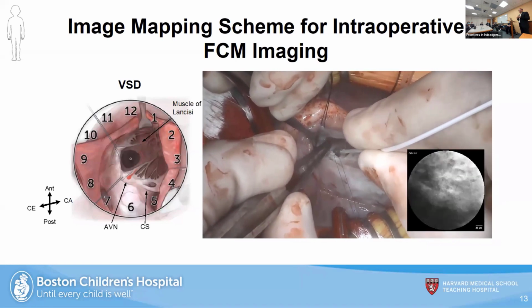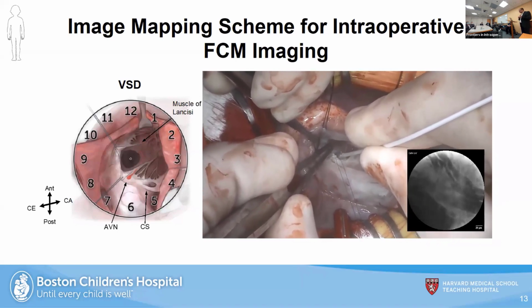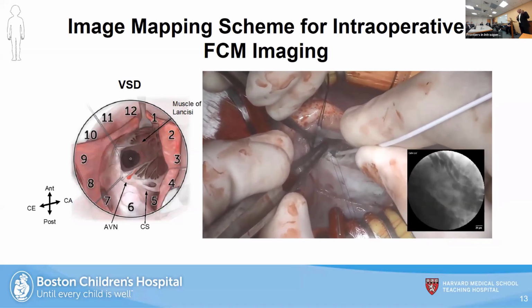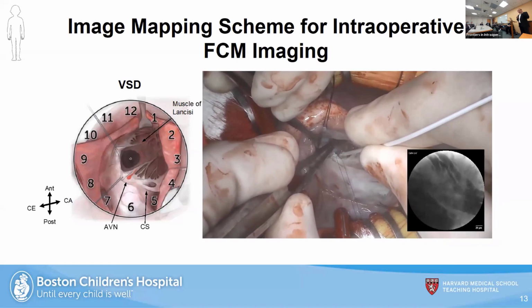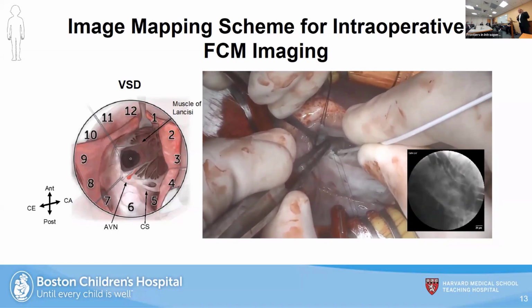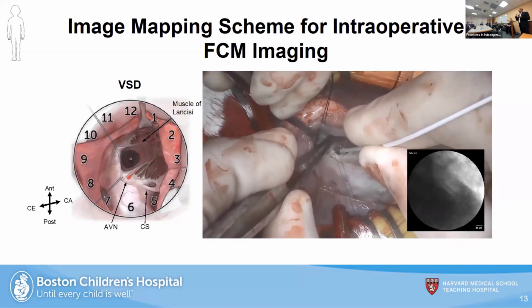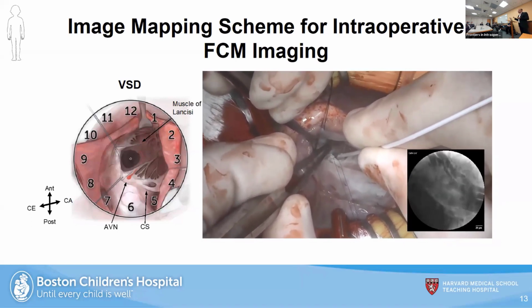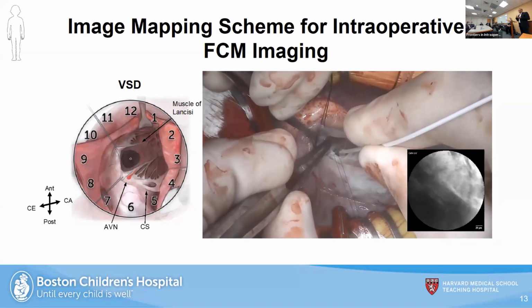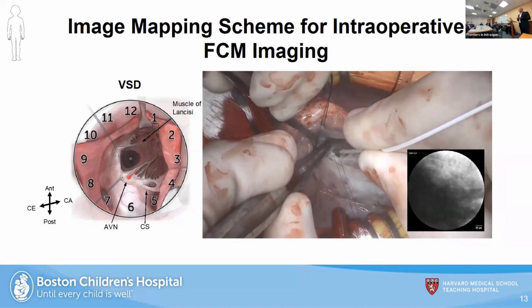Here, in one of the VSD cases, with the clock phase aligned, the surgeon is imaging with the probe at close to between 3 and 4 o'clock, where they have identified the conduction tissue. During the surgery, the surgeon would communicate which clock phase they are imaging to the assistant, who will record and mark whether conduction tissue was detected or it's regular myocardium.